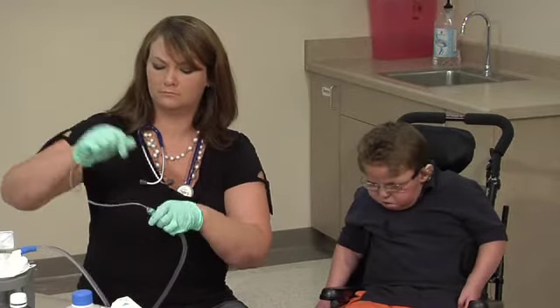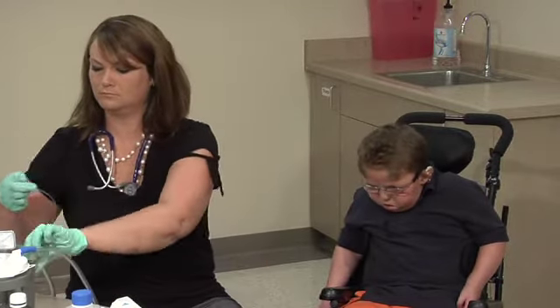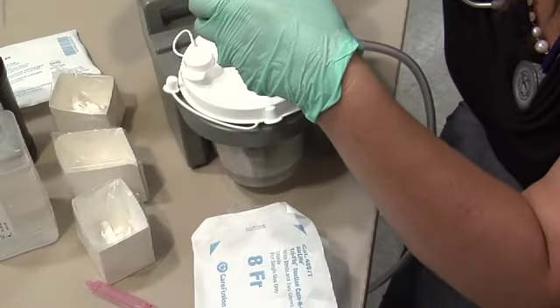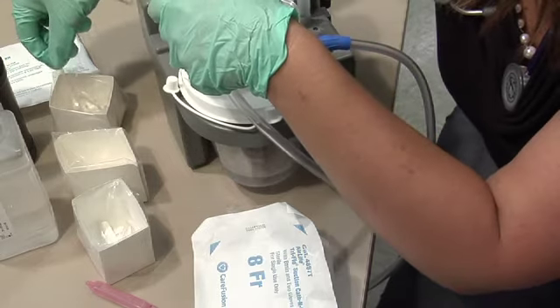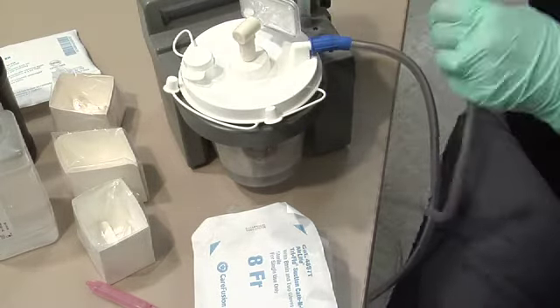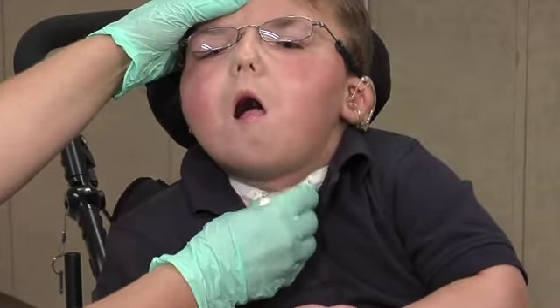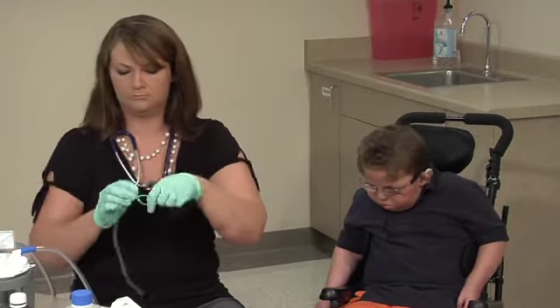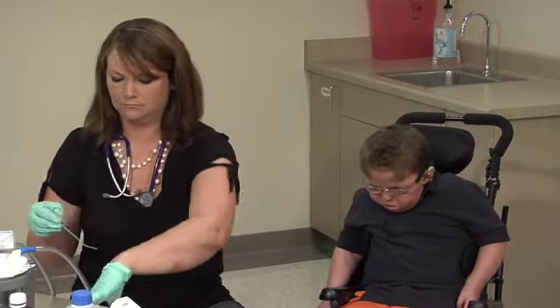If you are reusing the catheter for tracheostomy suctioning, use a separate catheter to suction the mouth and nose. Rinse the suction catheter with half-strength hydrogen peroxide or vinegar water, then rinse the catheter with sterile water or follow the procedure used by the family. Place the artificial nose back on the tracheostomy. Place the suction catheter in a clean container. The suction catheter can be used for up to 8 hours.